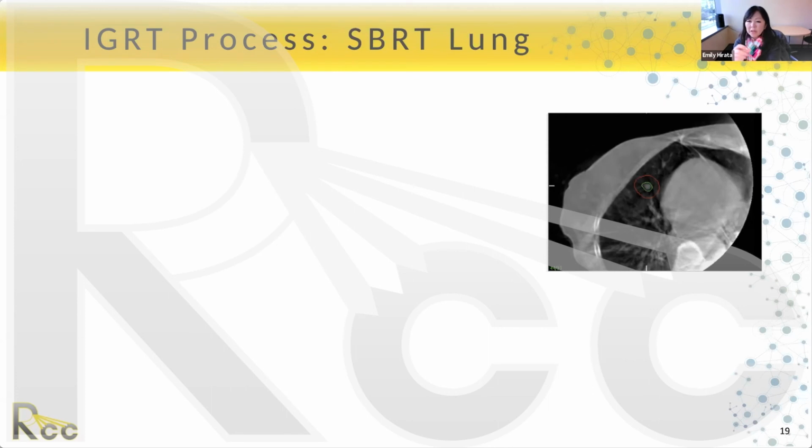If your tumor is distal from your central axis, a little bit of rotation is going to have a lot of effect, right? You're just talking about sort of radial geometry here. So I generally wouldn't see rotations, certainly not more than 1 degree. But again, this is another reason why it's important to be at the console to see the images.